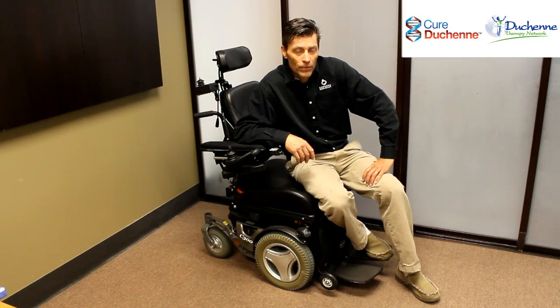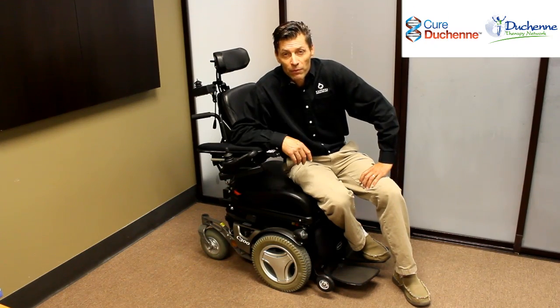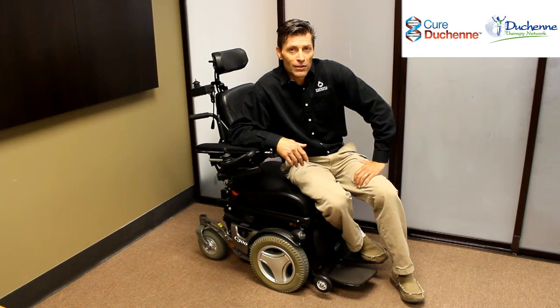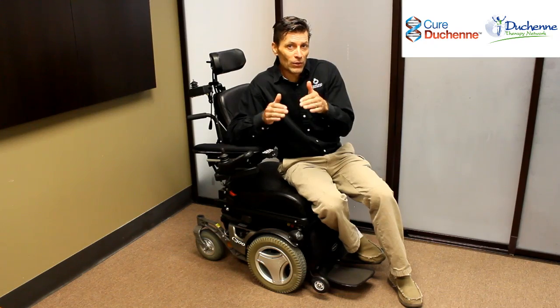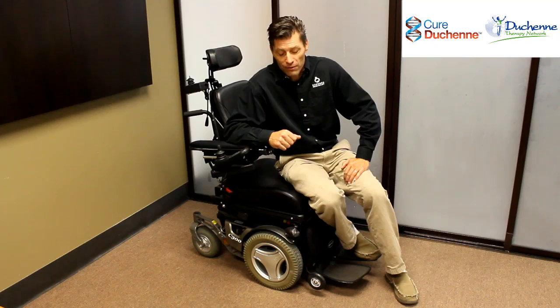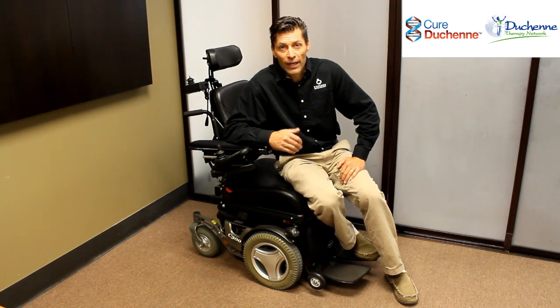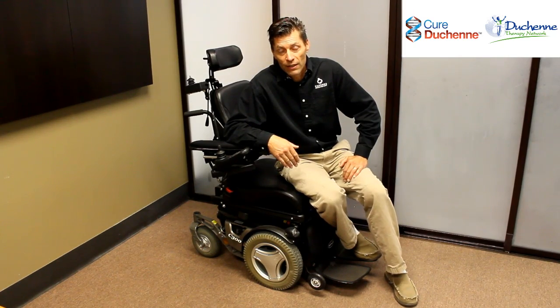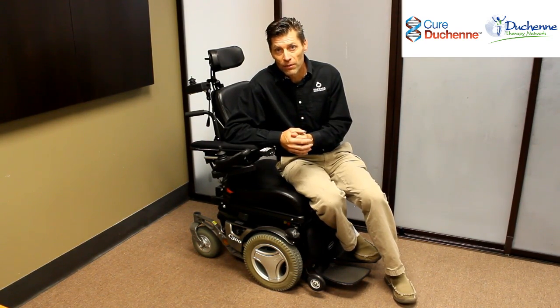Very important. The first thing we're going to talk about when it comes to buying a new power wheelchair is what kind of chair you're going to pick out. There's a dizzying array of options for different wheelchairs that are available, so I'm going to help you narrow it down quickly if you're looking for a wheelchair for someone with Duchenne's muscular dystrophy. First of all, you can cut out all of the low-level chairs that only have a captain seat or a fixed position seat. The chairs that are more capable and can handle powered seating are considered a Group 3 or a rehab type of base.